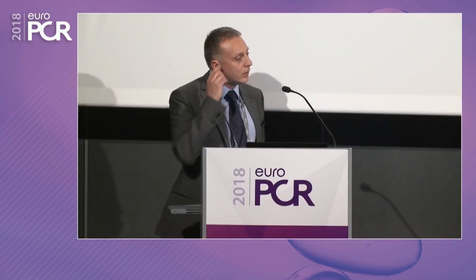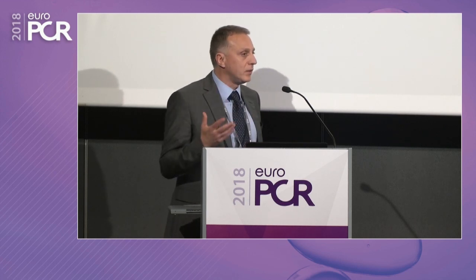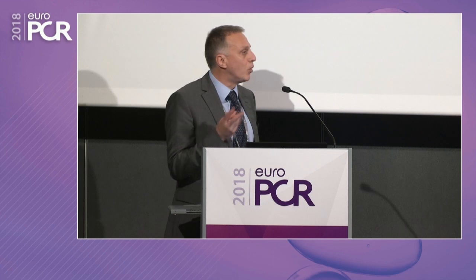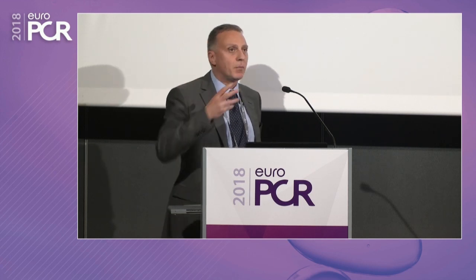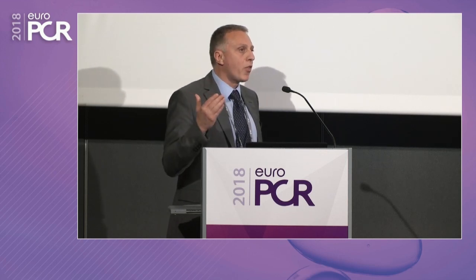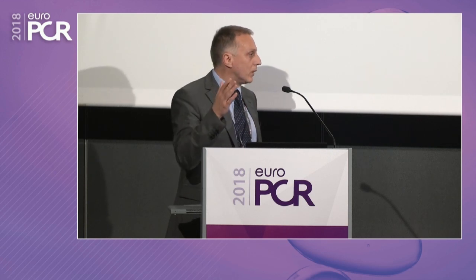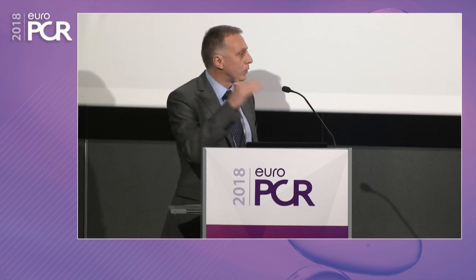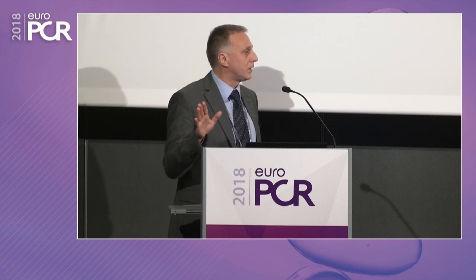Regarding the other techniques, I think that culotte, first of all, is recognized as a double stenting technique, but is basically a double provisional technique. This should be kept in mind because when you see a lot of disease, a Medina 1-1 lesion with a lot of disease, you think, okay, I should stent both. I will not care about the double layer of stent struts in the proximal part, and I will do the culotte. But to perform culotte correctly, you should perform a provisional twice. You have twice the need for this rewiring to have this fantastic result.